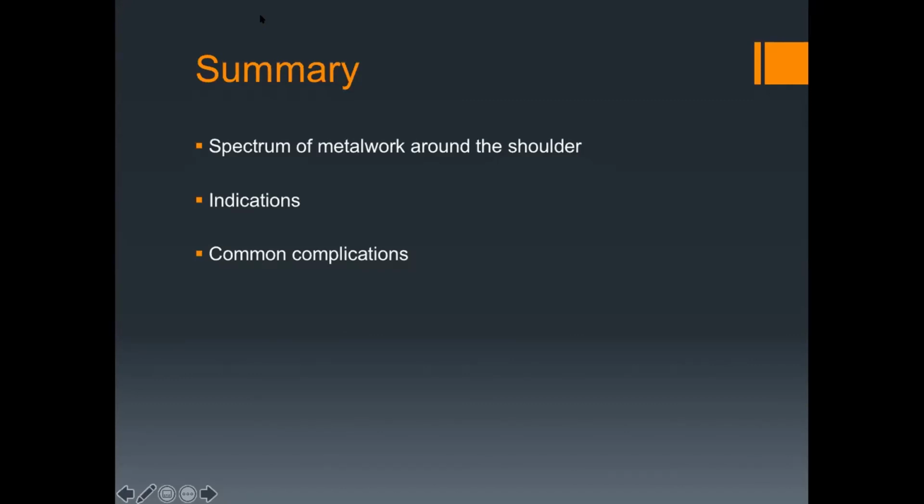I think they lose their blood supply. And that is the main reason there's been a big push towards reverse arthroplasty for fractures, because then it doesn't matter so much, because the rotator cuff isn't required to provide a fulcrum. It's the prosthesis itself, which is a fixed fulcrum prosthesis, that provides that fulcrum for the deltoid to work.